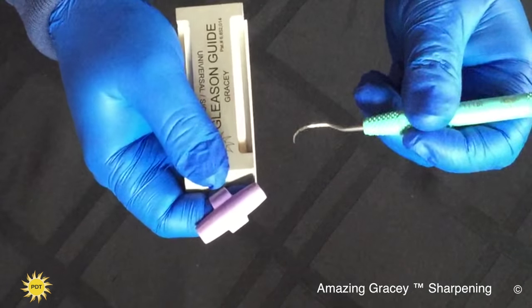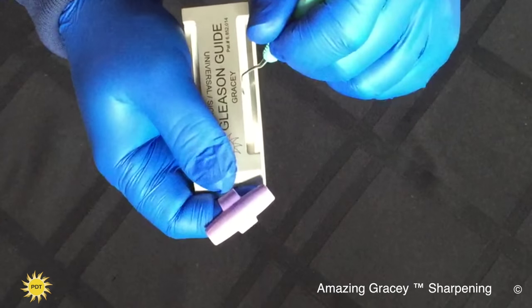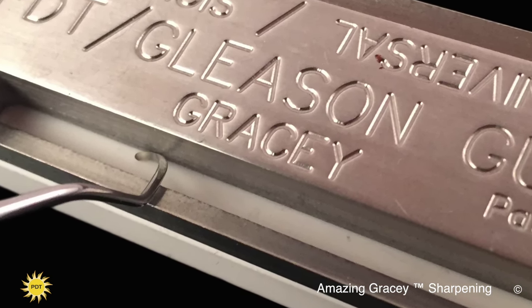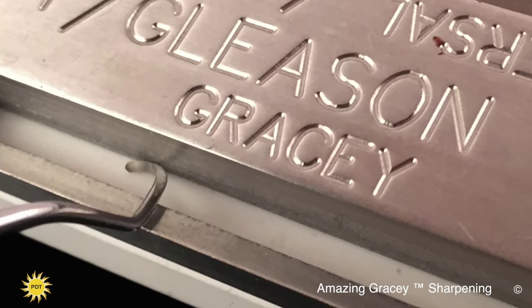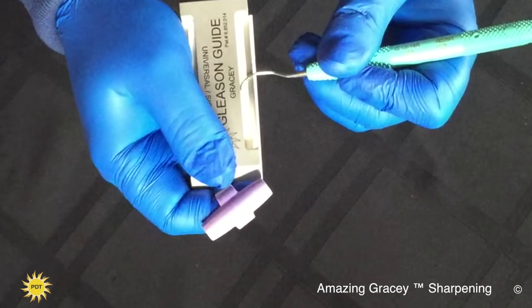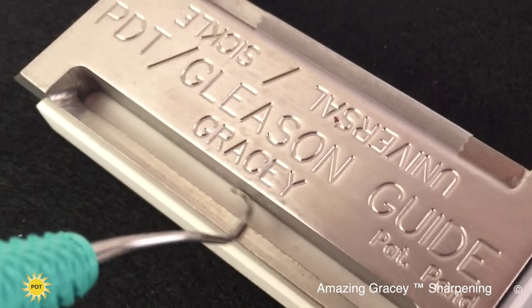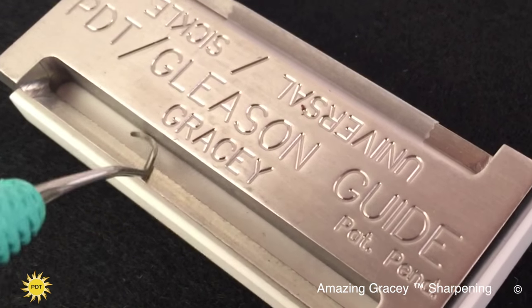To do the other cutting edge, you simply flip the instrument, place the middle of the back of the blade against the back of the guide, rest the terminal shank on the rest bar, and again start your pendulum swing, taking the toe off the back of the guide and bringing it back until it rests against the backstop.